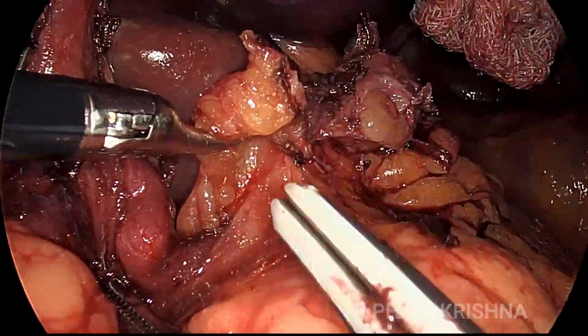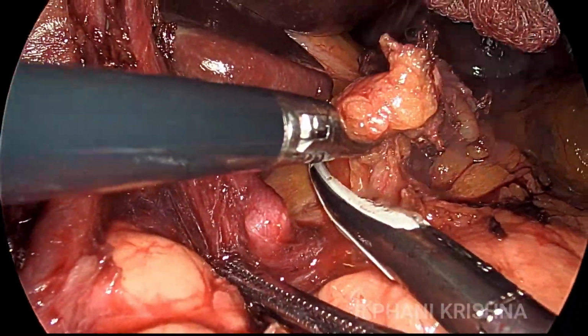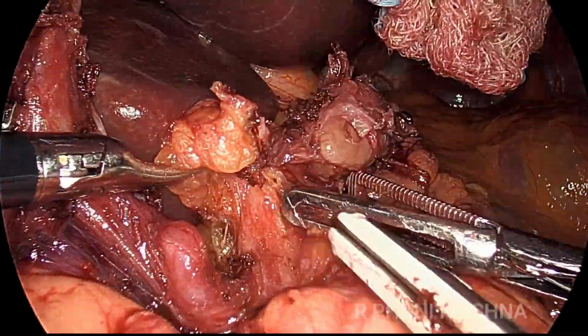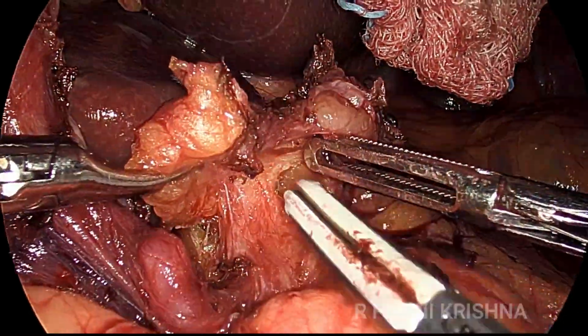This is very patient dissection. One more structure which we should avoid injuring here is the coronary vein. It's better to identify it and clip it neatly because it can tear and cause troublesome bleeding.